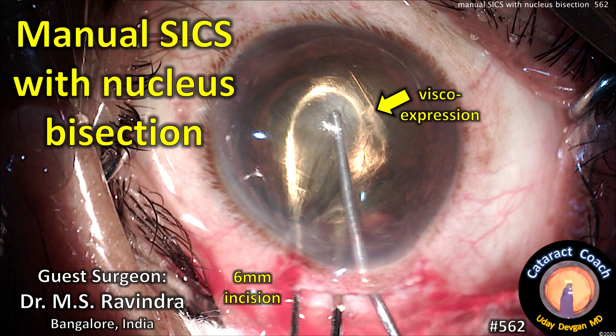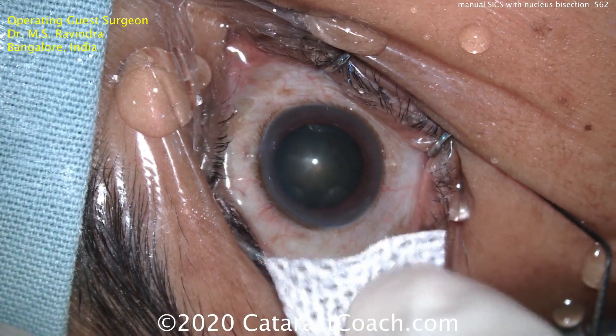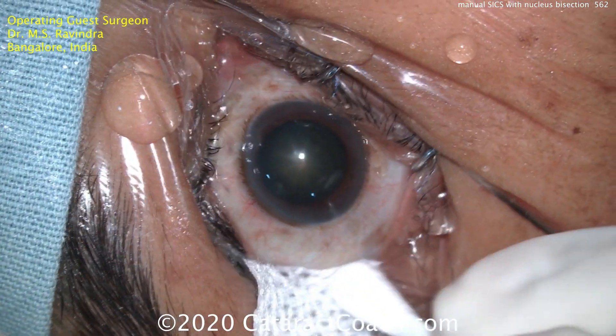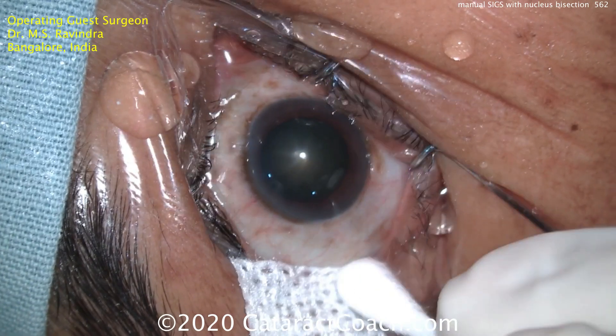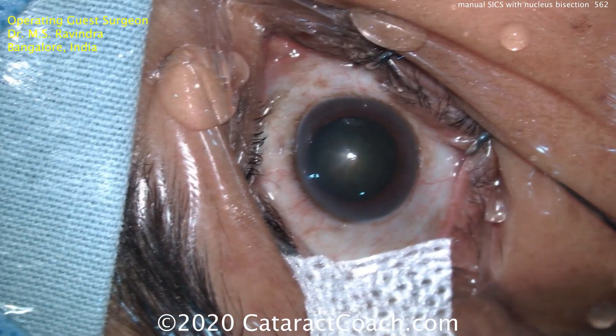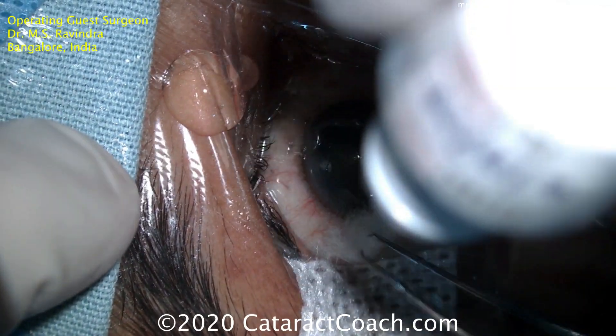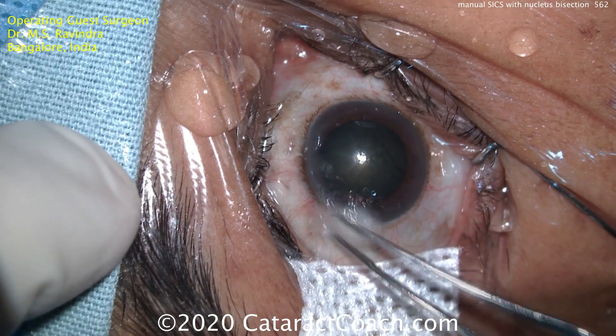CataractCoach.com — manual SICS with nucleus bisection, with guest surgeon Dr. M.S. Ravindra from Bangalore, India. SICS is small incision cataract surgery, a way of manually expressing the nucleus without using phacoemulsification, with a relatively small incision. It's far better than the older technique of large incision extracapsular surgery with the corneal scleral scissors.